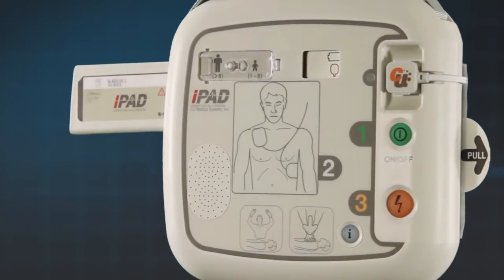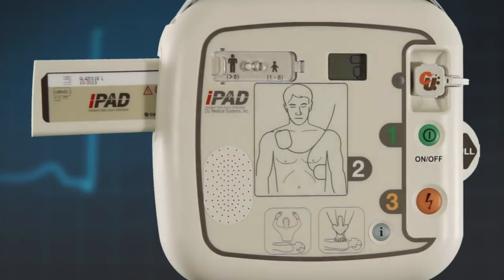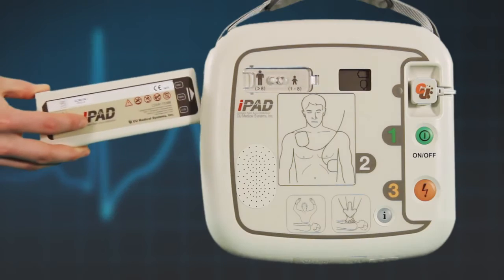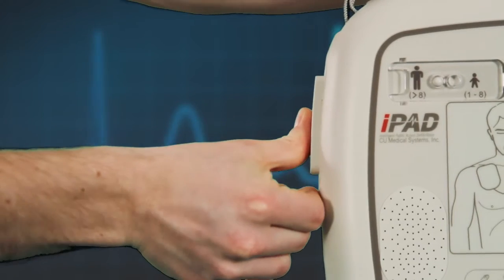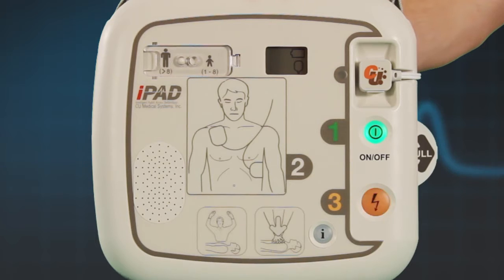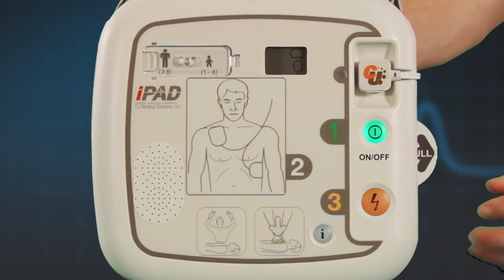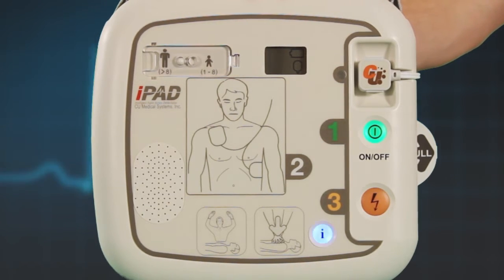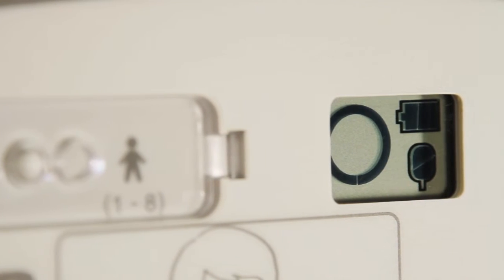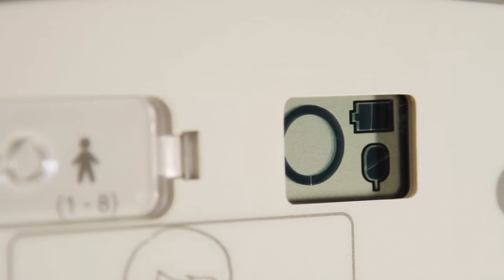Next, insert the battery pack into the side of the AED in the direction of the arrow on the label. Push it firmly until you hear it click into place. The iPad SP1 AED will now go through a series of self-tests. Follow the prompts and press the flashing buttons when told to do so. Once this process is complete, the AED will turn off. Check the unit status window to confirm that the AED is now ready for use.